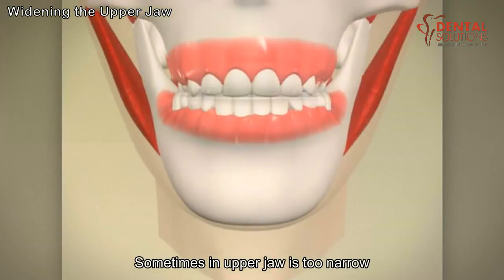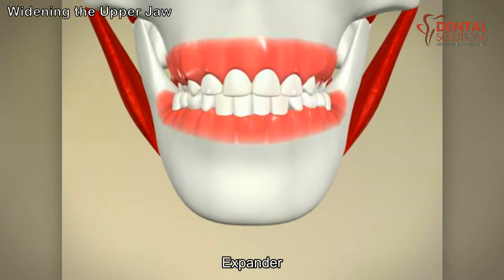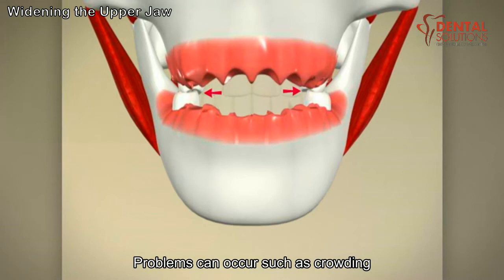Sometimes an upper jaw is too narrow and needs to be widened with a rapid palatal expander. If the arch is not expanded, problems can occur such as crowding and the teeth may not bite together properly.